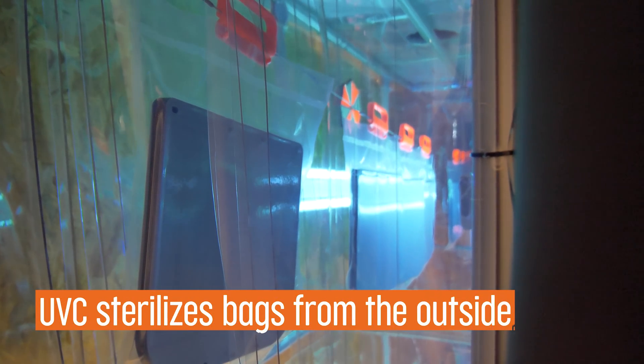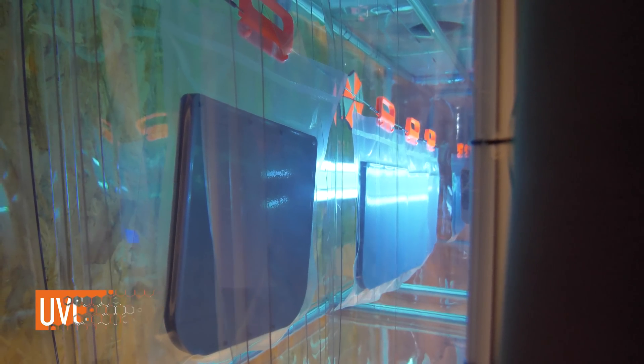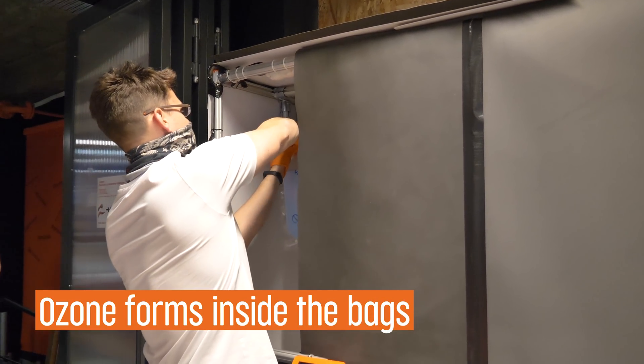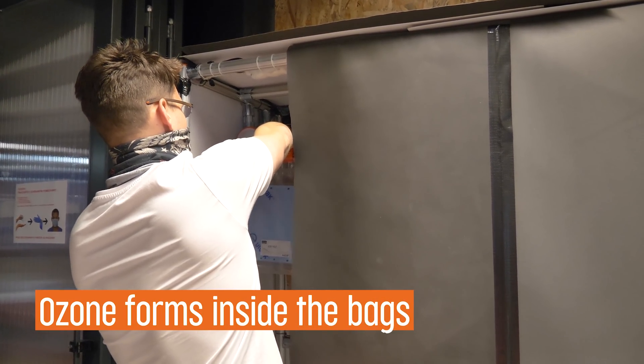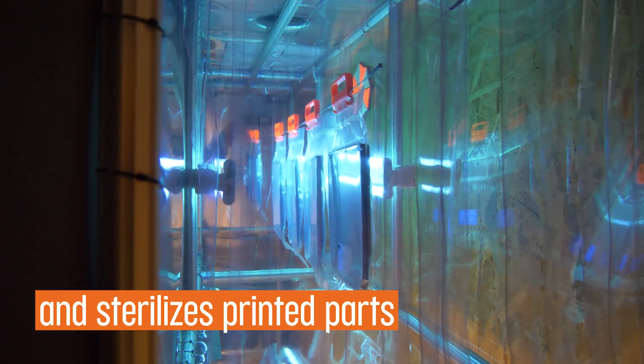Using ultraviolet UVC light, it once again disinfects all the parts we produce. All bags are hung on these printed clips and they slowly go through the line. Then they're collected at the end and put on a shelf marked as disinfected, and after that they go to packaging.